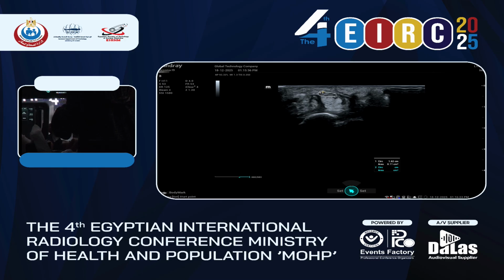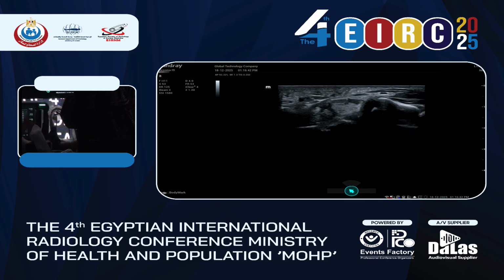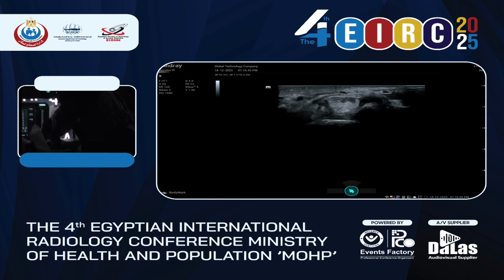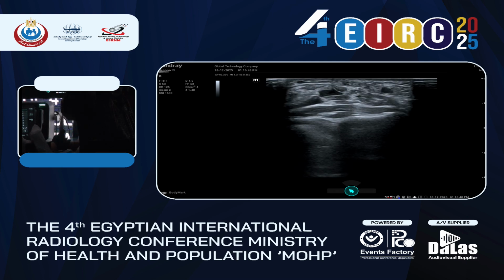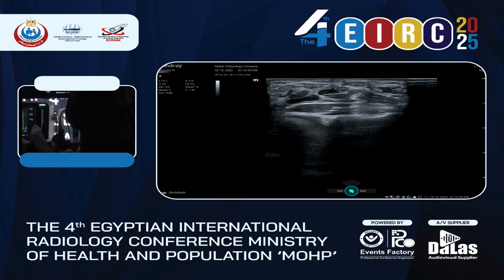Again, there are anatomical variations, there are anthropometric differences, and all of these should be taken into consideration. That's why we have 3 ways to do it. We check with the other hand. We create also the wrist to forearm ratio. So what we do here, we trace the nerve at the wrist, and then we move our probe proximally. We find the pronator quadratus muscle, which is this big flat muscle here. And at this level, we trace the nerve again in the same way.